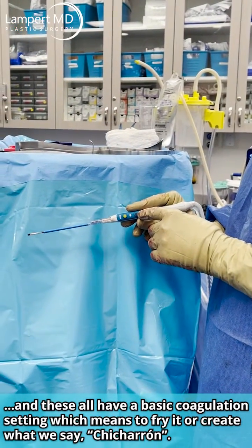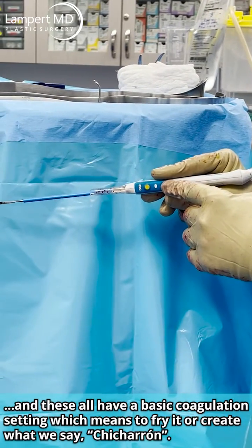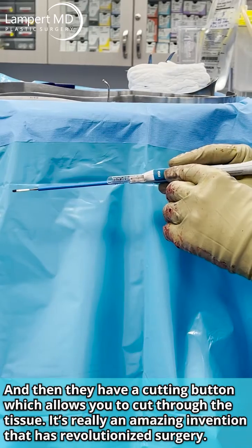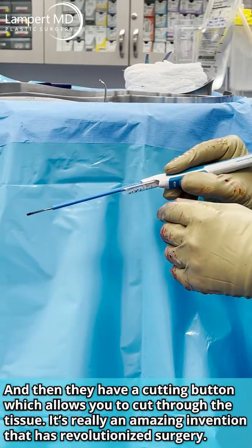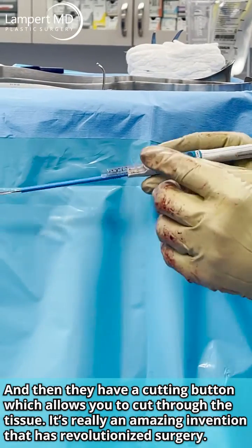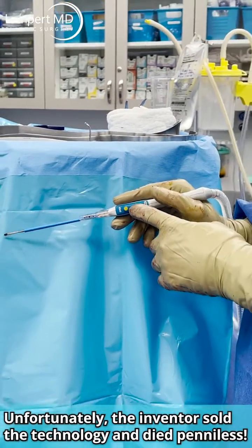These all have a basic coagulation setting, which means to kind of fry it — or as we say, chicharron — and then they have a cutting button, which allows you to cut through the tissue. It's a really amazing invention that has revolutionized surgery. Unfortunately, the inventor sold the technology and died penniless.